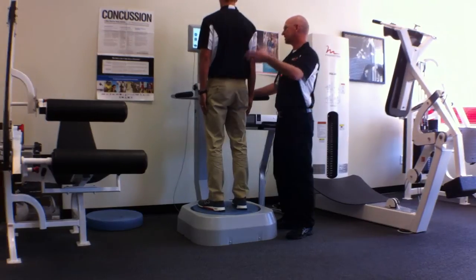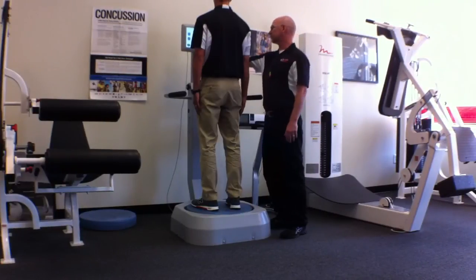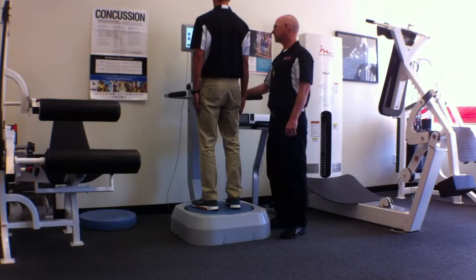After that 10 seconds, it's going to immediately engage back into an unstable position, but at level 12. Are you ready? So then we're going to go another round. It gives you 3 trials on this, so that's going to average that. So you maybe get a better representation if for some reason one of those trials is a little bit off. It will average that out, and it won't unduly give them a high fall risk or vice versa.